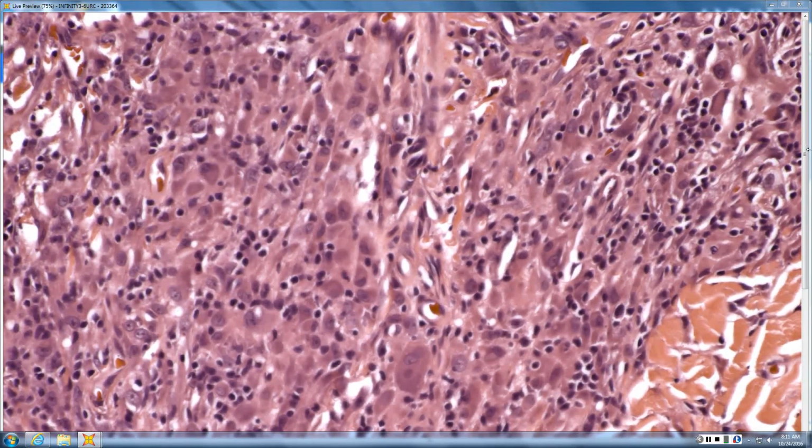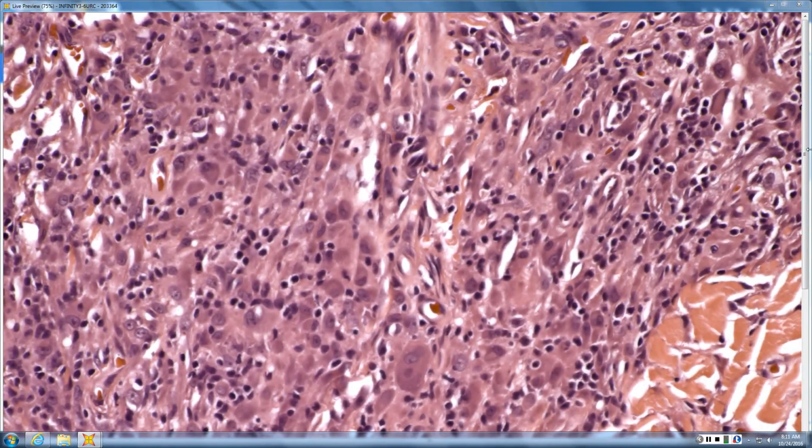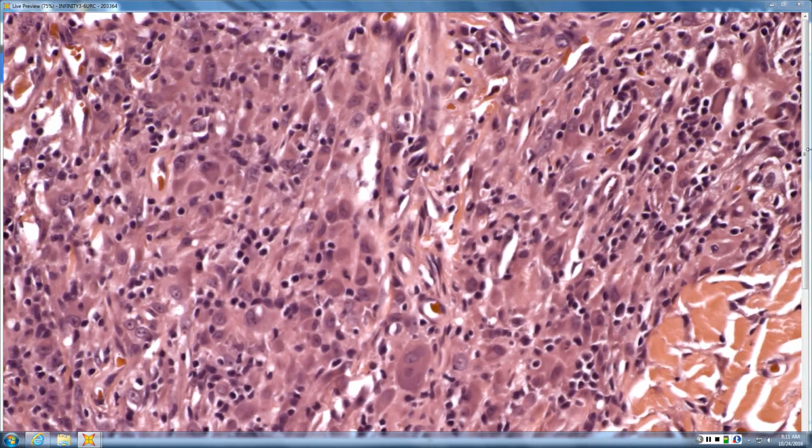So how about the same kind of cytology with the two-tone cytoplasm in the melanocytic world? I don't know, like a Spitz. Like Spitz, exactly. That is exactly right.